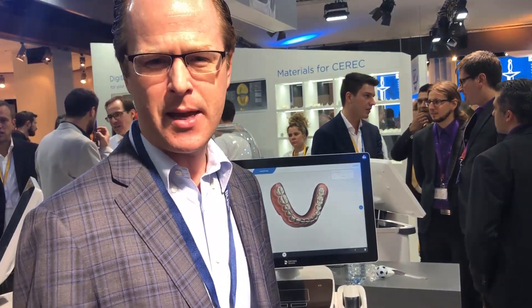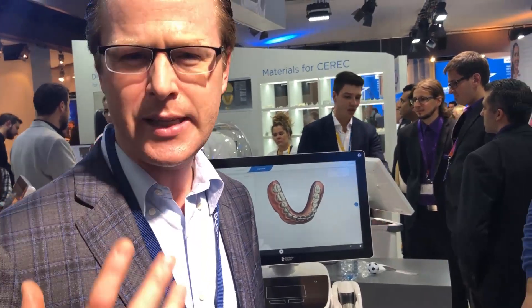Hi everybody, this is Dr. Scheer again here from IDS Cologne. We're here in the Dentsply Sirona booth checking out the Prime Scan. I've already had a chance to review it, seen it earlier, but I really wanted to go ahead and give this scanner a real fierce shake, do a denture scan 360 degrees, because it's really kind of aiming at having the opportunity of bringing together a very clean scanner.